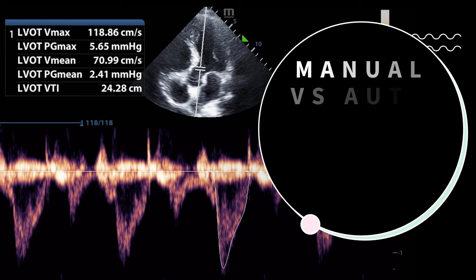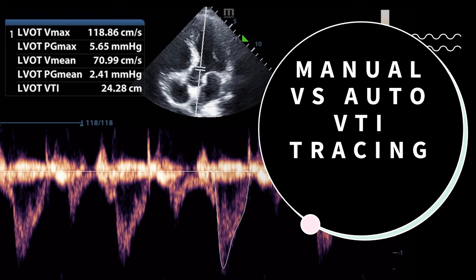To trace the LVOT Doppler signal, the old method was to manually trace the border of the Doppler signal. All ultrasound machines can perform this VTI function — it may take a little practice, but it's not very difficult. However, in the last few years, many of the major POCUS manufacturers have automated VTI software built into the machine. If available, the software will automatically measure multiple VTIs and average them for you. Some machines will also place the sample gate at the proper LVOT location using artificial intelligence. Check your machine or contact your local sales rep if you're not sure.